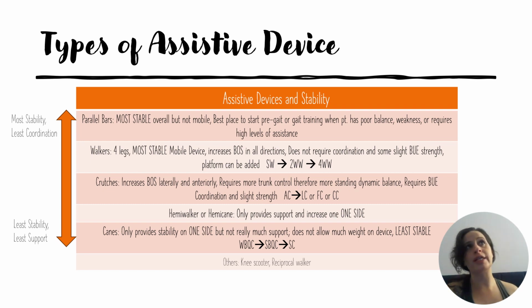which if you think about coordination and just neuro concepts, like how much cognition that also requires, right? Because in order for us to be coordinated, we have to do smooth movements with both sides of our body, and that requires a lot of cognition as well. So sometimes your neuro patients are going to have a hard time with crutches. Maybe the Lofstrand crutches could work with a lot of our patients, which we do tend to use with neuro patients, but they have to not have that cognition part be damaged, that impairment to the cognition. Okay.